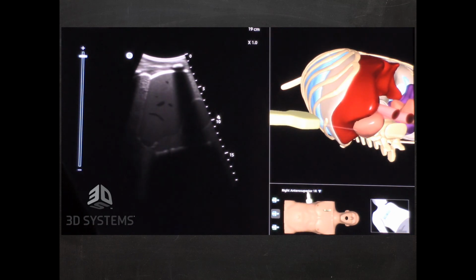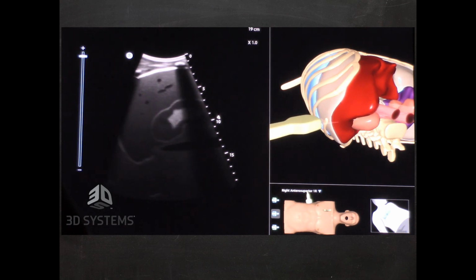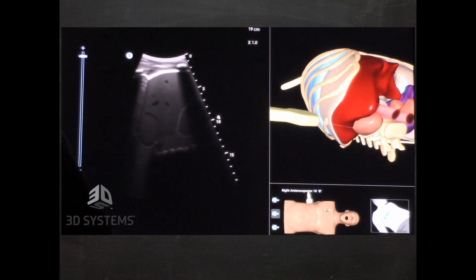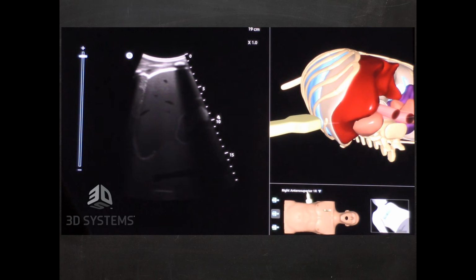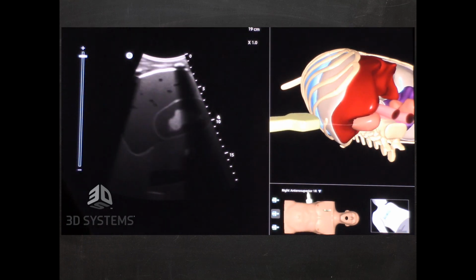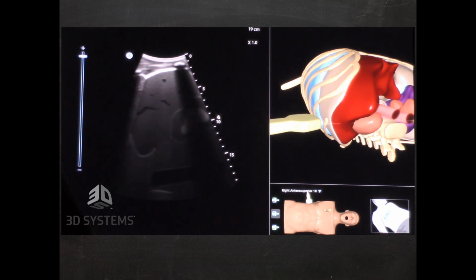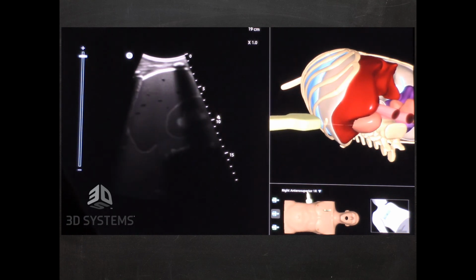Okay, now let's look at the anatomy in the sonographic image. You can see on the anatomical representation that your beam is passing through the liver here as it travels towards the spine. Anatomical landmarks are going to be really helpful here. So if you see your aorta or your IVC, you know your beam is anterior to the spine. On the left, if you see stomach medial to the spleen, you are also too far anterior, and that is a really common mistake. If you see kidney, you know your beam is traveling in the retroperitoneal space, and you're going to be relatively close to having a good image. The abdominal cavity should take up at least half of the sonographic image if you're doing this right.